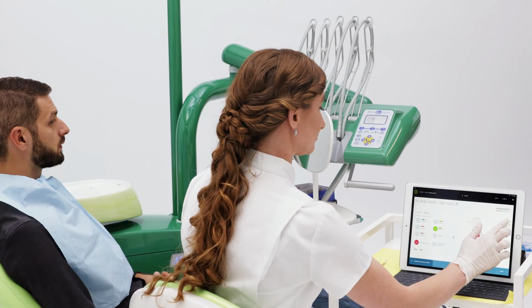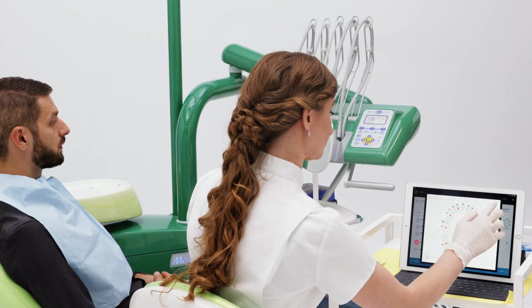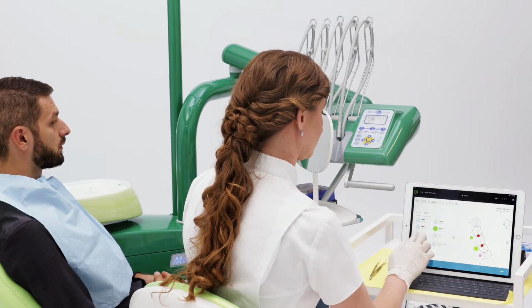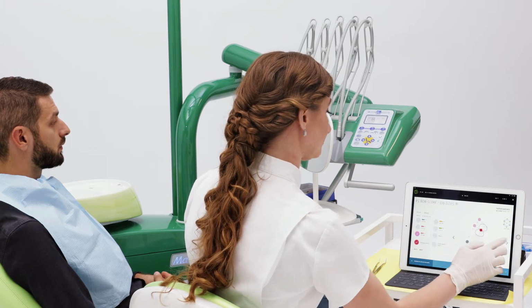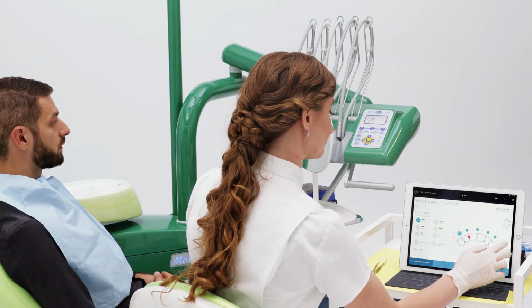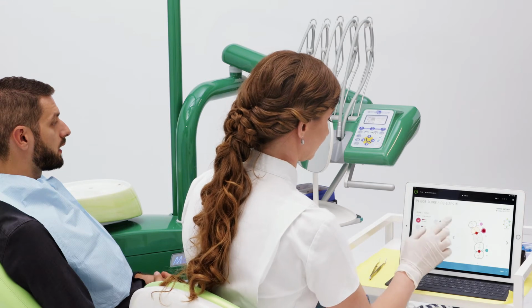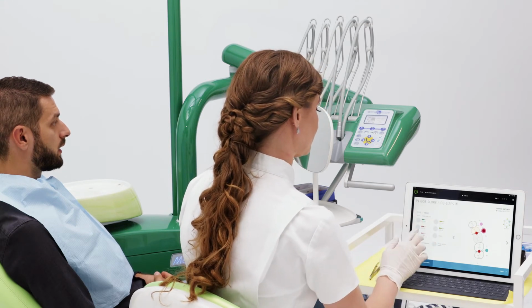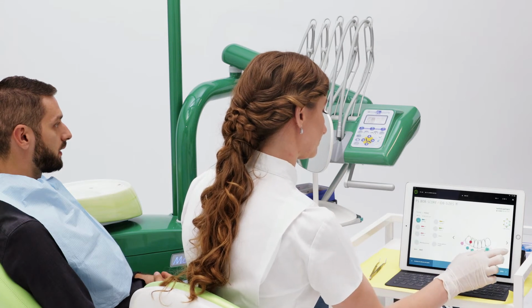The review and coach begins by bringing up my patient's full mouth map, which I am then able to review. As it is my patient's first visit today, I return to the score to minimise the quantity of aids in his chart. I decide to change the green and red Perio 405 to the pink prime, which is the next largest size already in his score.